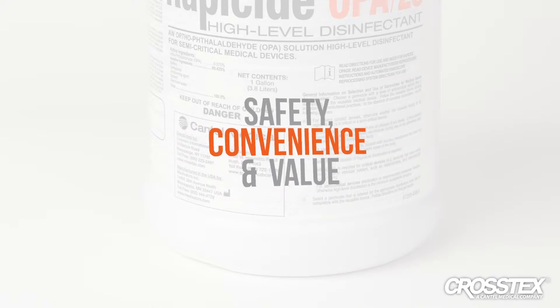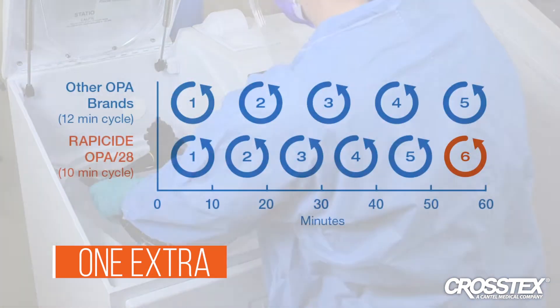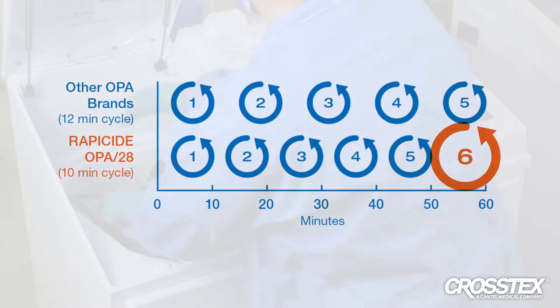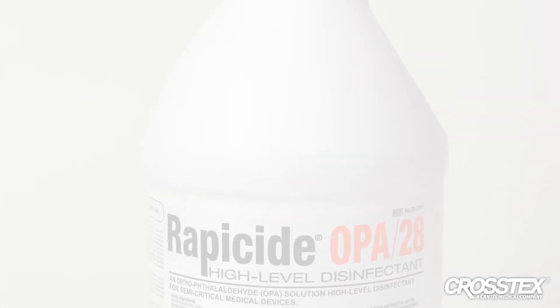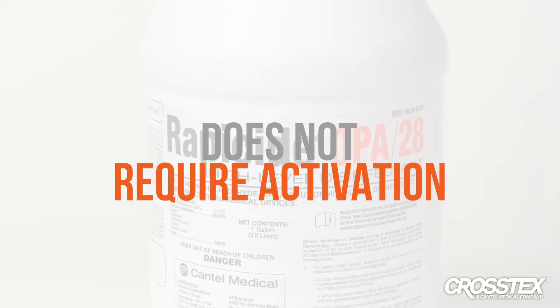Rappaside OPA28's 10-minute manual disinfection contact time provides one extra disinfection cycle for every five instruments reprocessed compared to 12-minute OPA, allowing you to reprocess one extra scope per hour and reduce downtime of medical devices. Rappaside OPA28 is supplied ready to use and does not require activation. Instrument cleaning is a crucial part of the decontamination process.